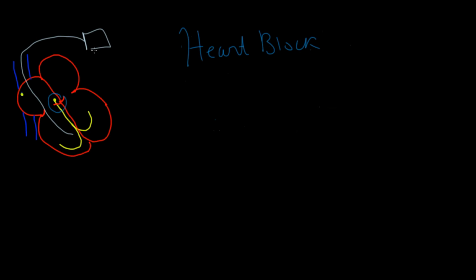Right. So I'm going to mention a few problems that can happen if you use a single chamber ventricular lead in complete heart block. So let's have a look again over there. This is a complete heart block picture. This is an escape beat. Right, so let's assume that we now have a ventricular pacemaker.